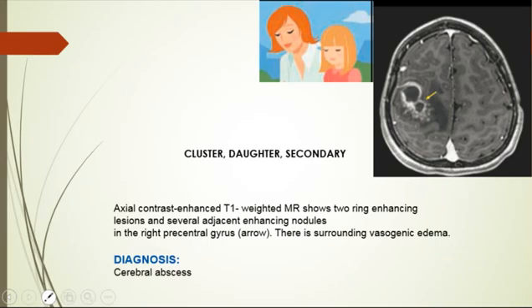It's the same abscess extending to the continuous tissues that are in front of it, okay? In addition, tumor growth is slow compared to the rapid evolution of the cerebral infection. Keep in mind timeline, abscess will develop from 0 to full to the late abscess in like 2 weeks. Tumor will need months, okay? In addition to the clinical data and the lab and all things.